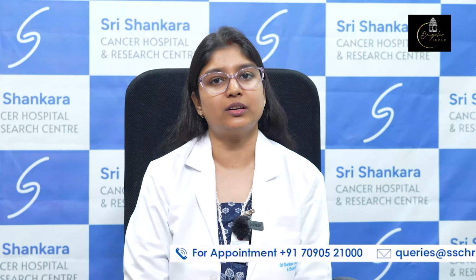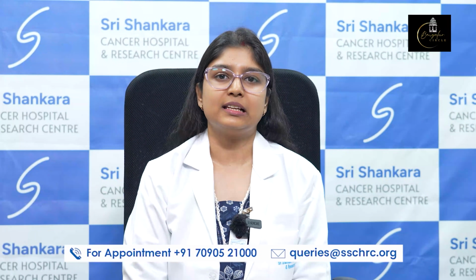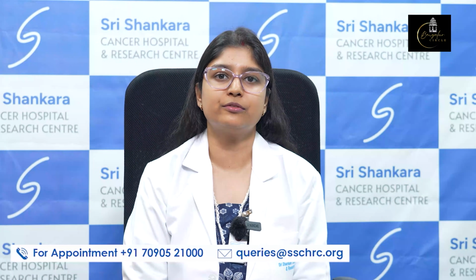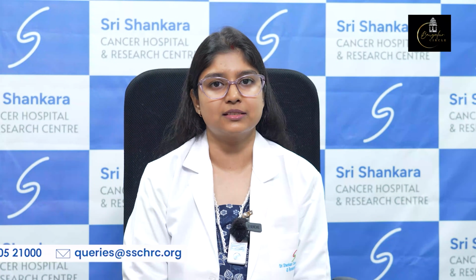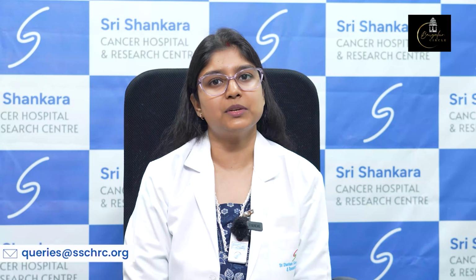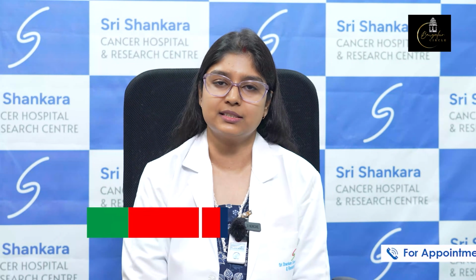Now we will look into certain patient preparations which are to be taken care of before a PET-CT is done or is advised. The patient has to be in a fasting state for around 6 hours. So if the patient is appointed for next day morning, from midnight it is preferable to be in a fasting state. During the fasting state, the patient can have plain water, but tea, coffee, coconut water or any juice are to be avoided. Only plain water is allowed during the fasting state.